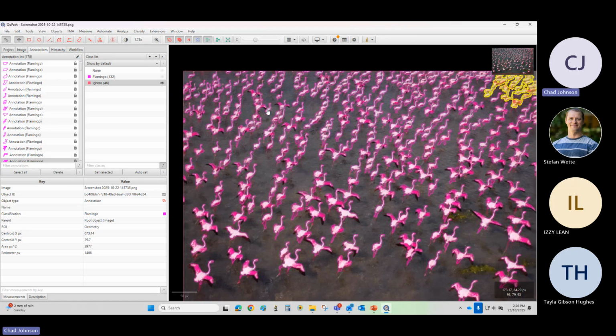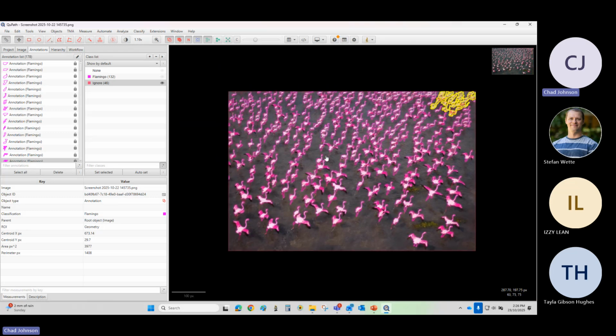Now there is the ability to, and I haven't investigated this too much because I'm Fiji scripting through and through, but if you want to, there is actually a way of writing scripts. So you can automate with the script editor. So you can create scripts to do analysis in bulk. I haven't investigated it because most of my work is done in Fiji anyway, and I haven't gotten around to it. But I think the coding language is very similar to Fiji anyway. You just need to know what the code for specific functions is in QuPath.